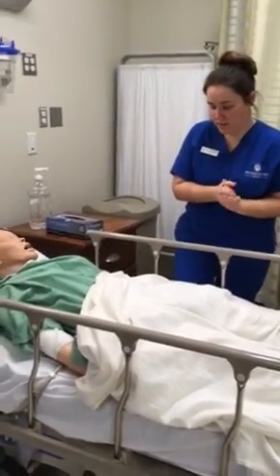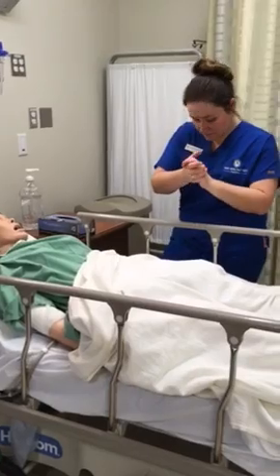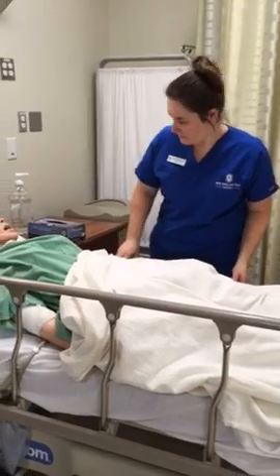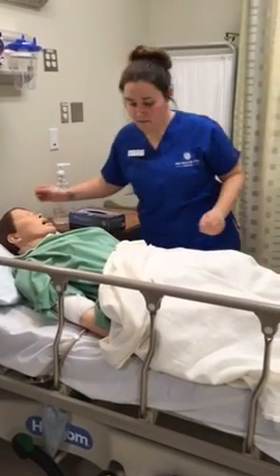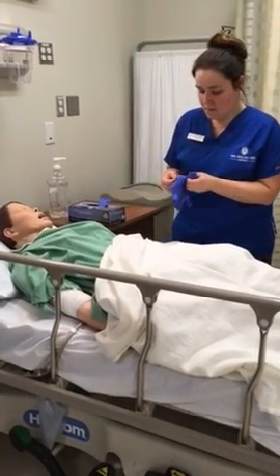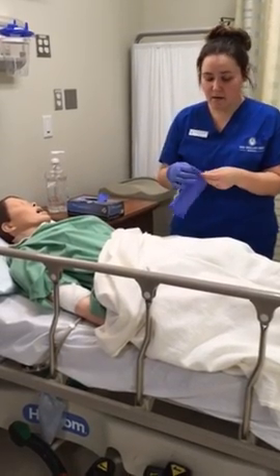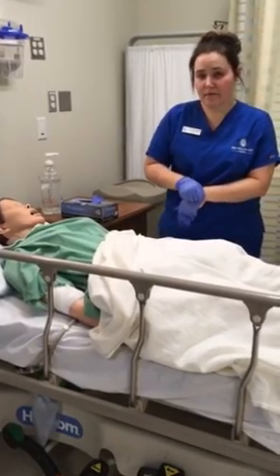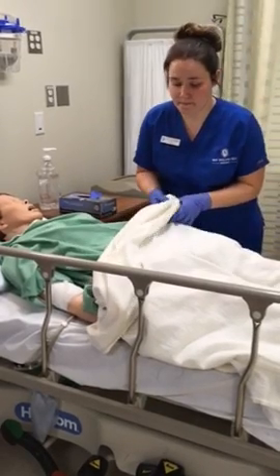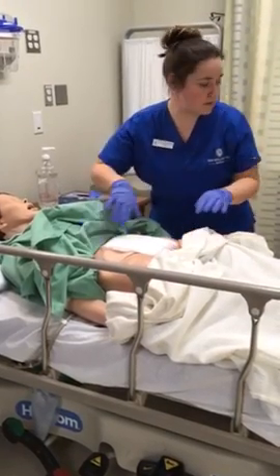I'm going to raise the bed to a working height. Make sure that the head of the bed is down. I'm going to go ahead and assess the wound and check for any bogginess. I'm going to assess the color of any drainage, the amount of the drainage, type of drainage, as well as the smell. Only exposing my patient as much as I have to.